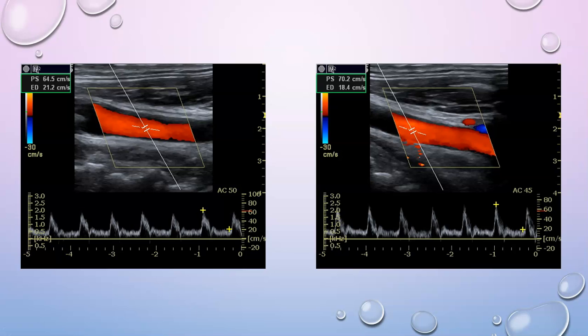So we see that changing the Doppler angle changes the Doppler shift, the frequency shift, but really doesn't affect the velocity. Okay, and that was the standardization that labs made. Before this, labs would utilize blind scanning probes or continuous wave probes. Everyone had no idea exactly what angle they were at, and so you had to use just the frequency shift to determine whether or not something was a diseased vessel. And so when they did that, it was very difficult to be consistent from lab to lab.